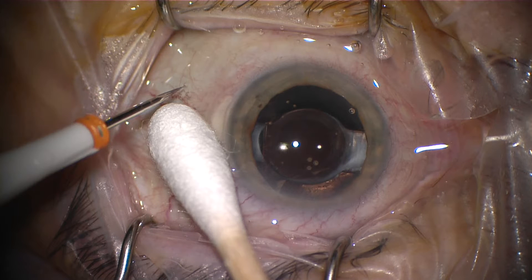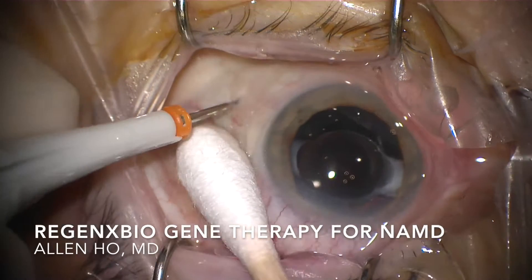This surgical video shows the steps in delivering subretinal gene therapy to a patient with neovascular AMD. In this Regenex trial, a transgene is delivered in the subretinal space which encodes for an anti-VEGF protein, therefore creating an ocular biofactory in the eye to control wet AMD.